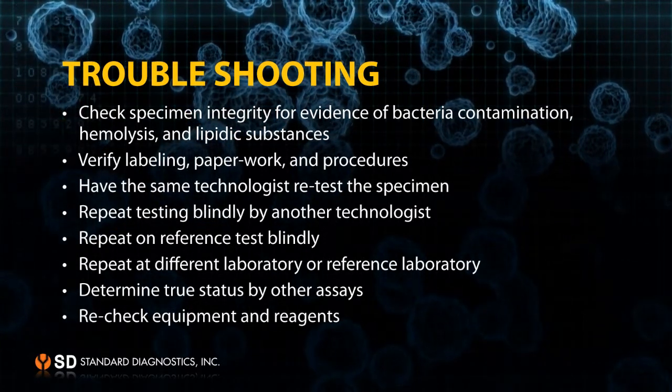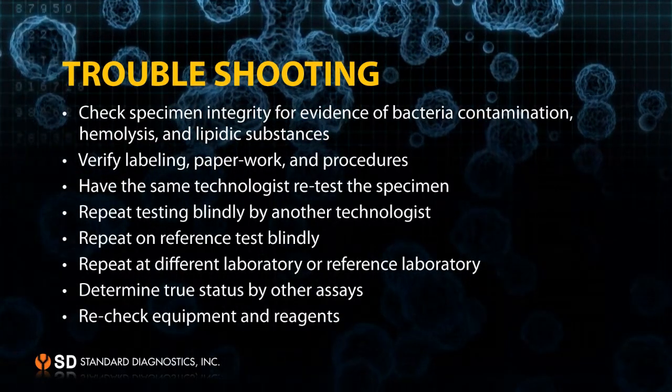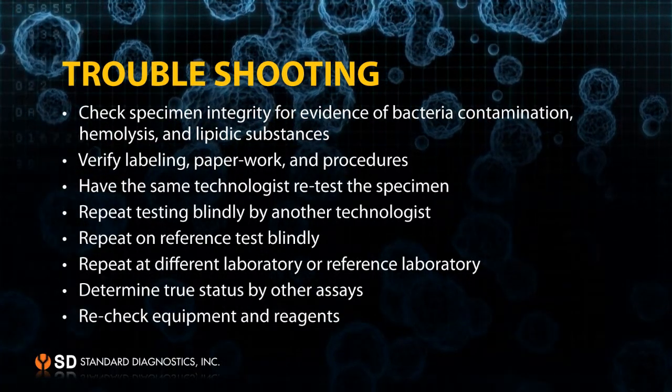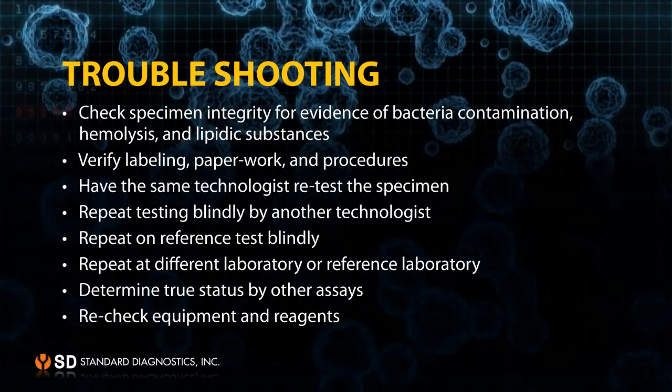Repeat on a reference test blindly. Repeat at a different laboratory or reference laboratory. Determine true status by other assays. Recheck equipment and reagents.